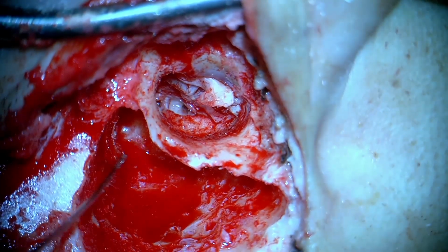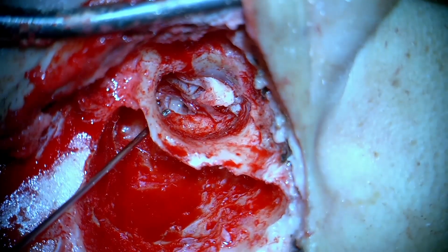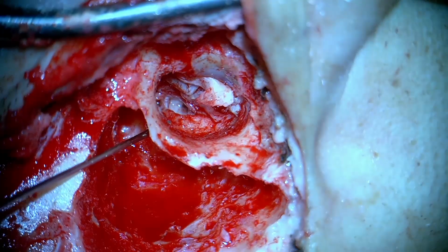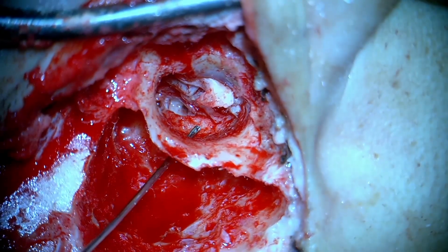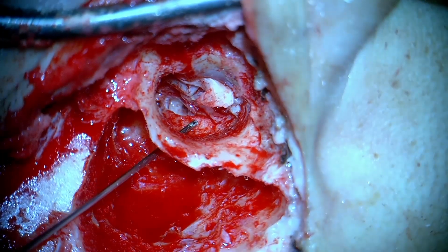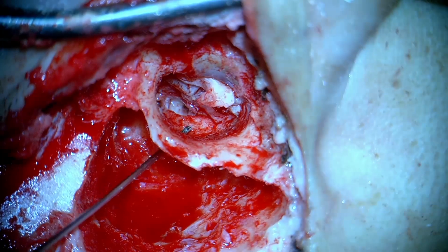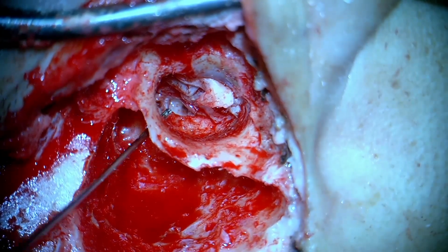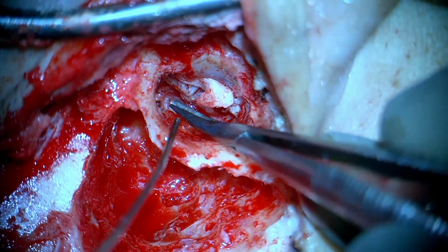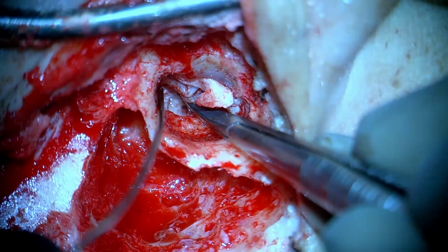Now we assess that the ossicular mobility seems to be all right. So there is erosion. You can see the size of the defect in the posterior canal wall as we are using our suction to go through that. It's quite a large defect of the posterior canal wall. An appropriate sized cartilage from the concha would be used to reconstruct this, as well as some portion of the bony scutum, which is eroded because of the disease.